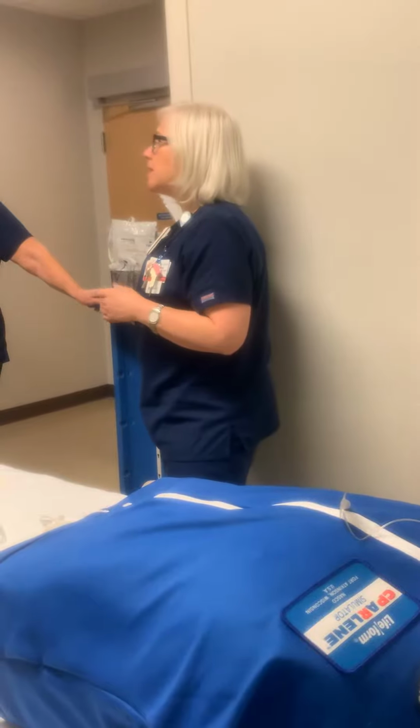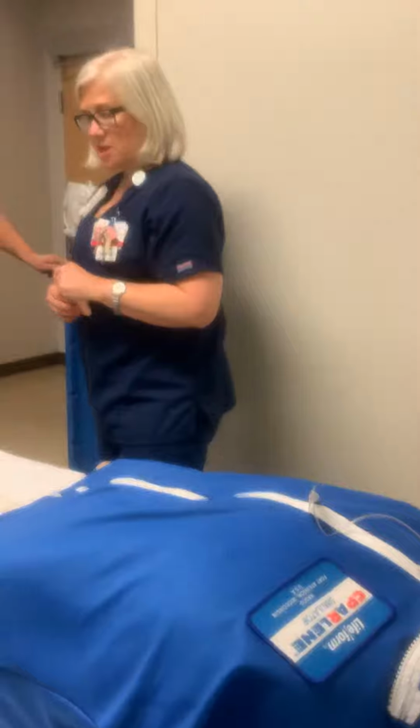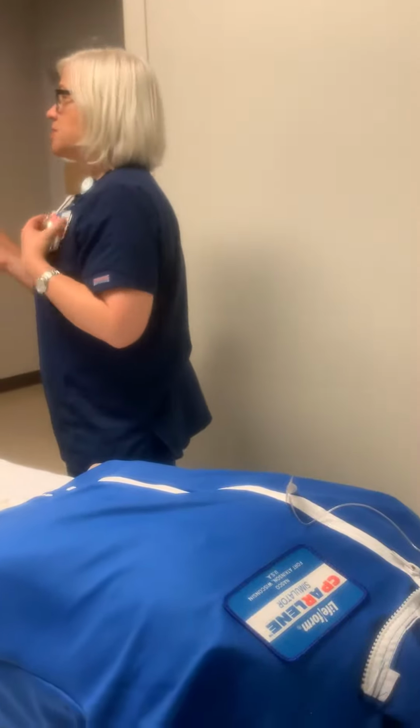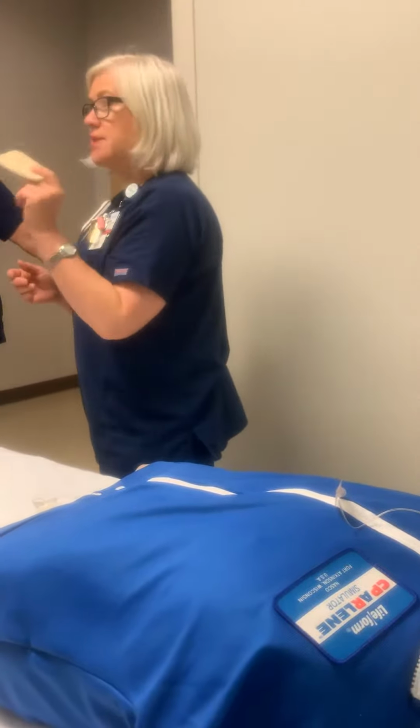That becomes a fallout on us now. So, yeah, I talked to Dr. Schallenberger about it, and we went with these things here, so you may want to just talk to him and say, I'd like to really put this underneath there. These can stay on for 7 days.